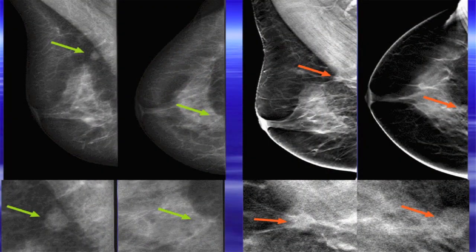Next set, please. Similar. So you see on this image, there's a little something there. And on this one, it's pointing to an area. But here's the tomosynthesis image. Whoa, it's way more. So it's nothing, nothing, nothing, nothing, something, then nothing, nothing, nothing, nothing. So when you get to the slice that has the something, you see something there that's way more conspicuous than the regular mammogram. So you say, oh, there's something. It has angles, it has shape, it has thickness.